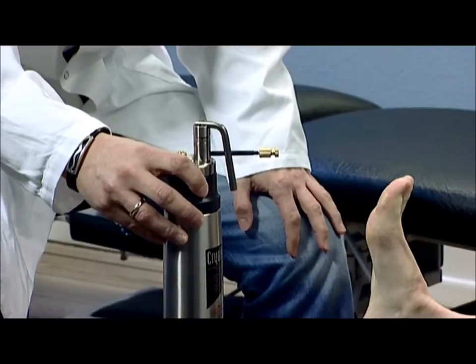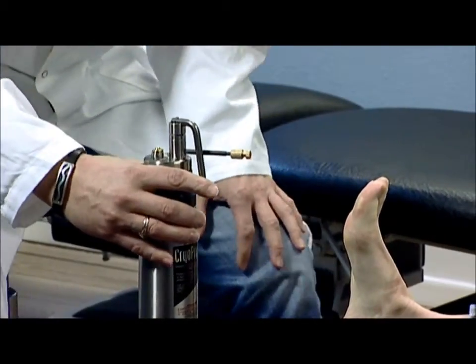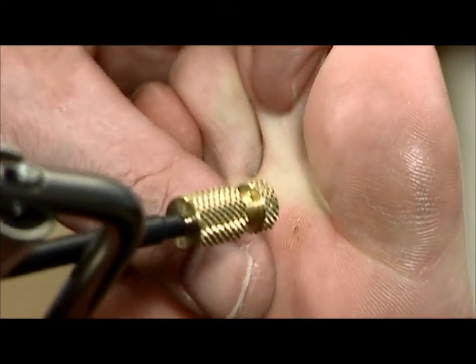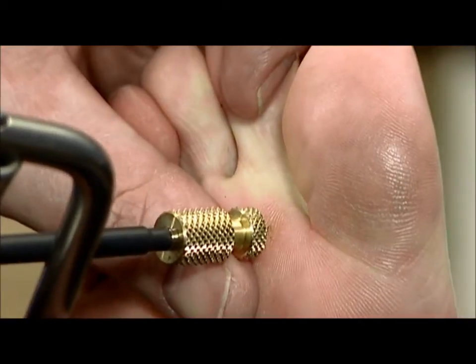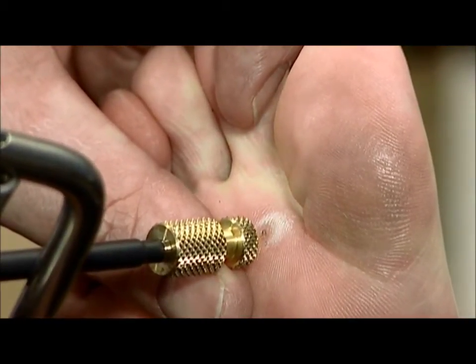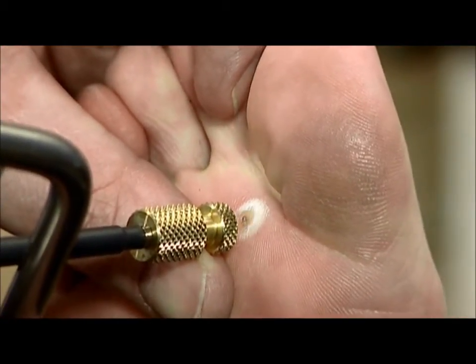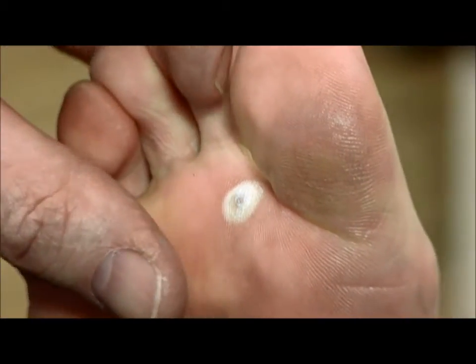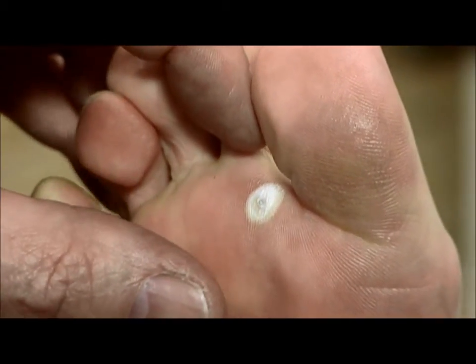A distance of approximately five millimeters also provides the most precise spray. As standard, a CryoPro unit comes with a set of six spray tips covering a majority of applications. The apertures vary in size from A through D, with D putting out the smallest amount of fluid. Simply choose a size which will freeze the lesion as quickly as possible, offering good control over the spray and minimal damage to healthy skin surrounding the lesion.